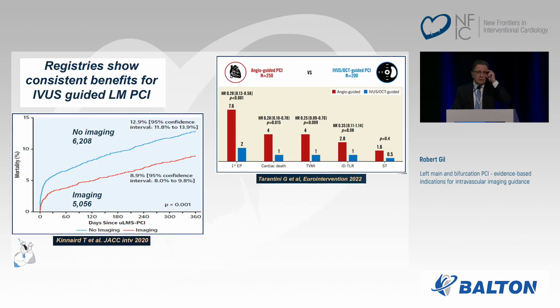If you take into consideration these evidence-based data gathered from many registries and trials, already mentioned by Professor Stankovic, we should remember that there is still the benefit of IVUS usage versus angio guidance. Here you can appreciate two trials.